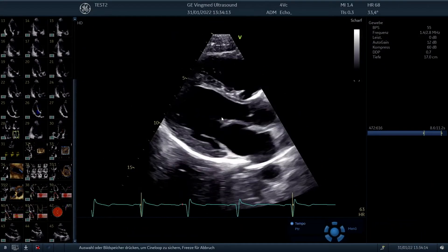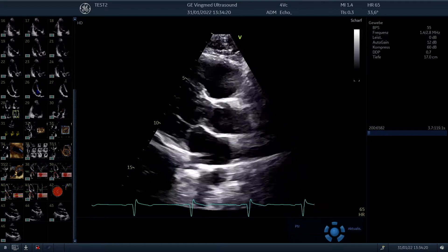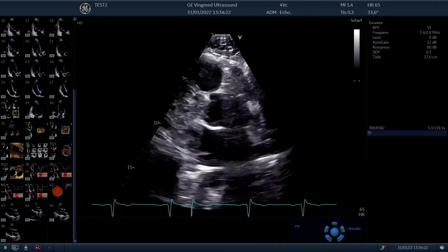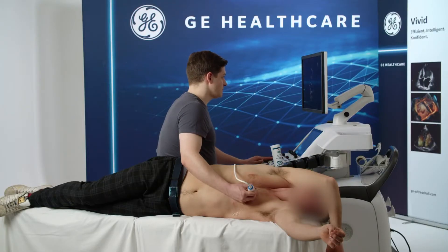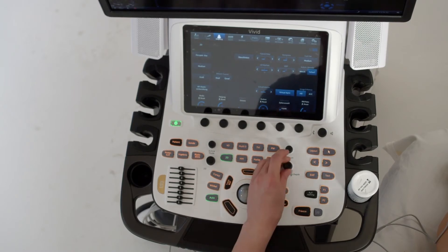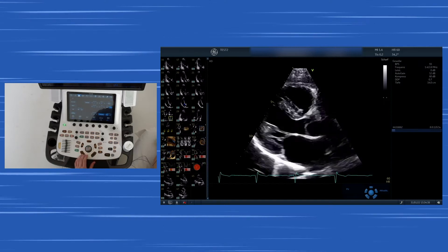We save this image and then we tilt the transducer or we move probably one intercostal space upwards to visualize the ascending aorta even more clearly. Here it is seen on the model and on the knobs you have to use. Always adapt the depth and the gain settings and try to create an optimal image.